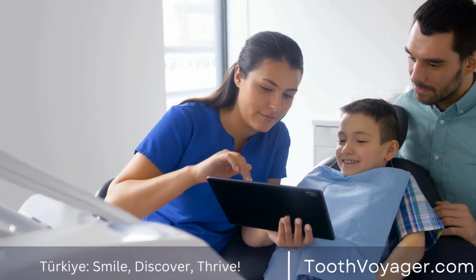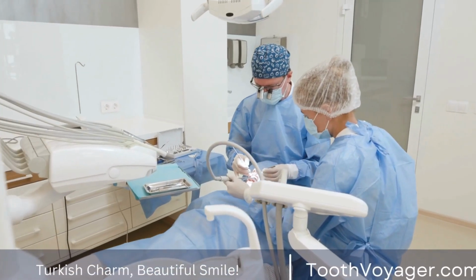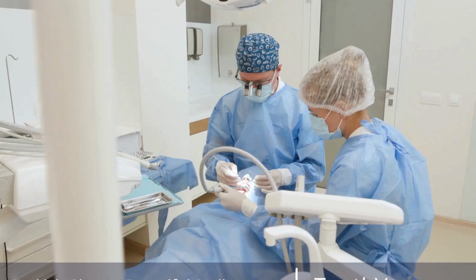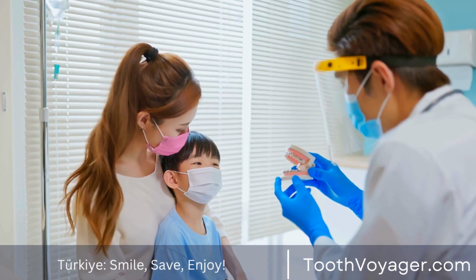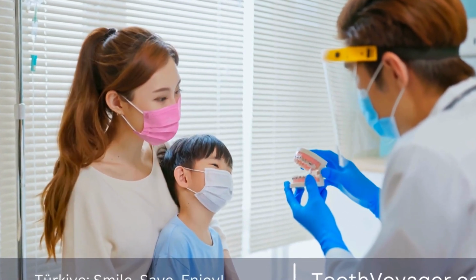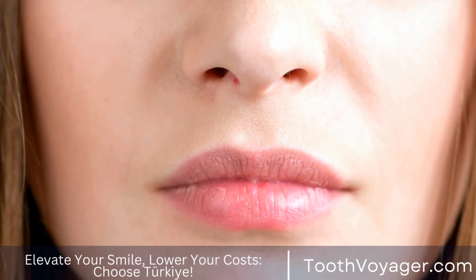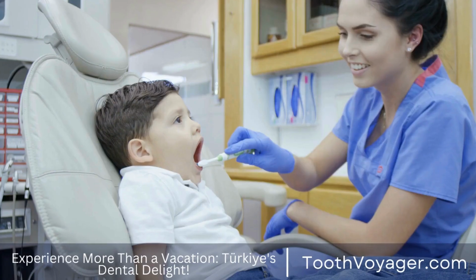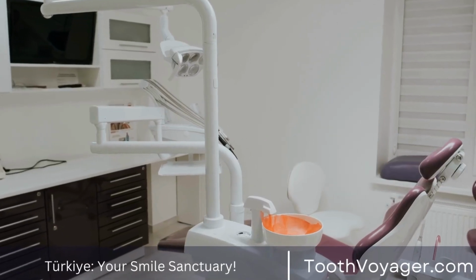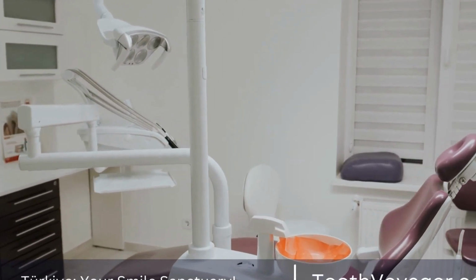3. Implant placement. The procedure of putting in dental implants is a surgical process that generally takes place with local anesthesia. Dental professionals will create an incision through the gums to expose the jawbone. This is where the implant is installed. A small cut is made into the jawbone. Then, the implant is placed into the bone. The gum tissue is put back together, and a temporary cap can be placed over the implant.